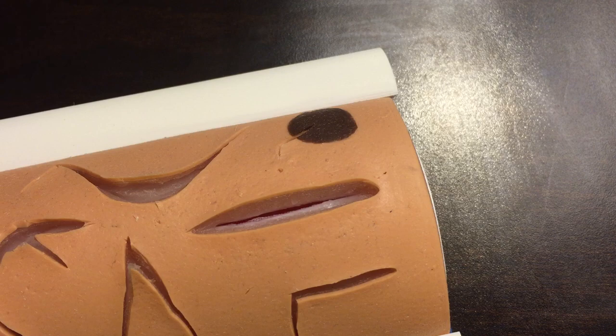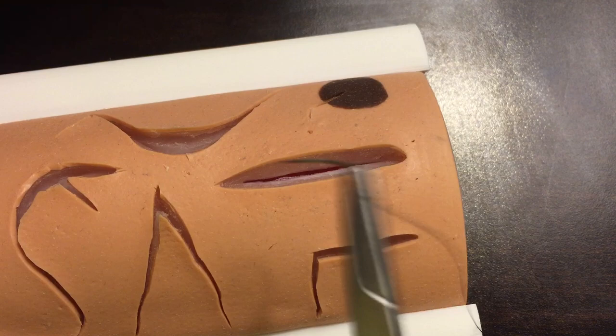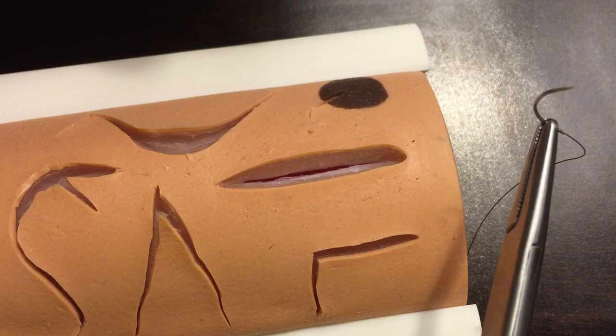Hi everyone, I'm going to demonstrate a subcuticular suture. Normally when we're suturing the skin we'll be at this kind of angle with the patient's laceration or incision, but when we're doing a subcuticular it's much easier to work at this kind of angle because we're going to work from right to left. The subcuticular suture is entirely underground.